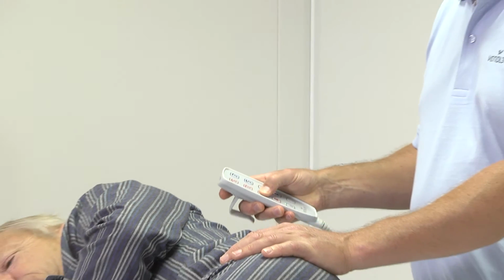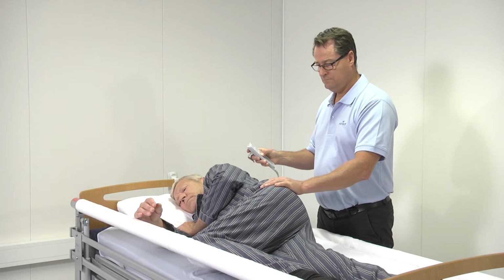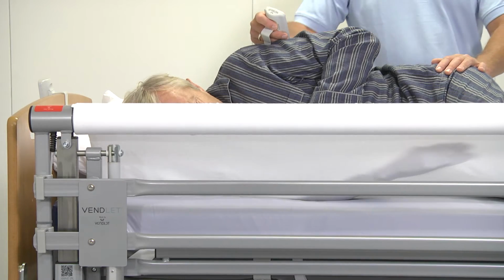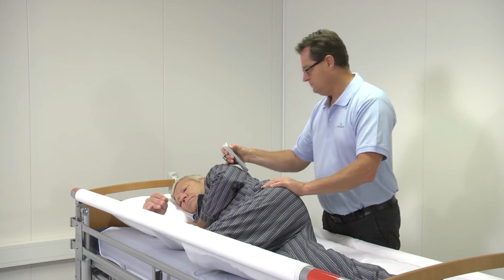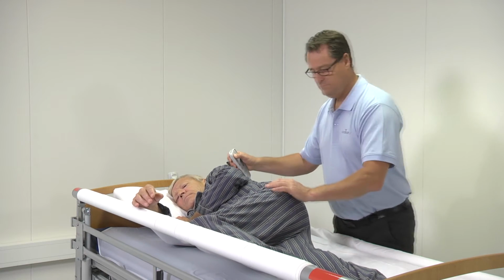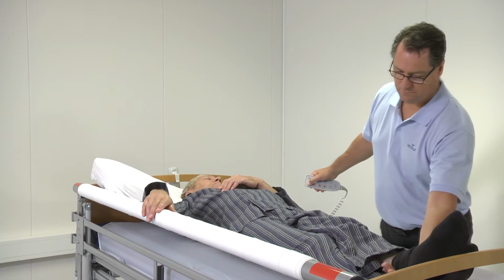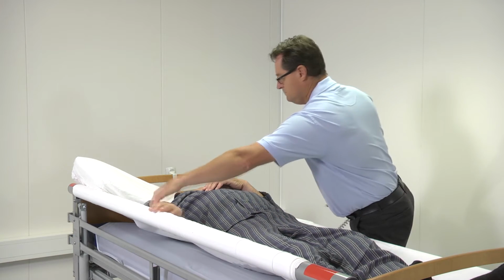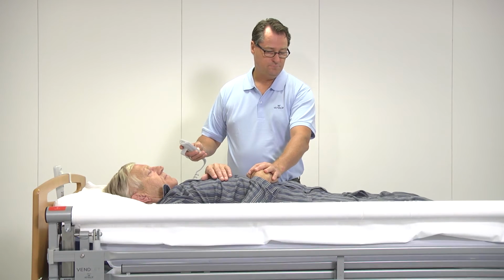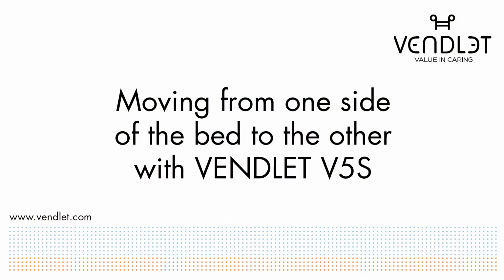When turning the client back to supine position, first raise the red bar. Then, wind the turning sheet onto the red bar and place the free hand below the client's right knee. Now move the hand down below the knee towards the ankle and guide the left foot over the right foot to place the patient in a supine position again. Before the client is left in the bed, the turning sheet is slackened on both sides.